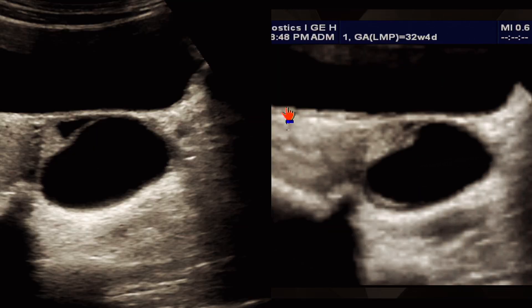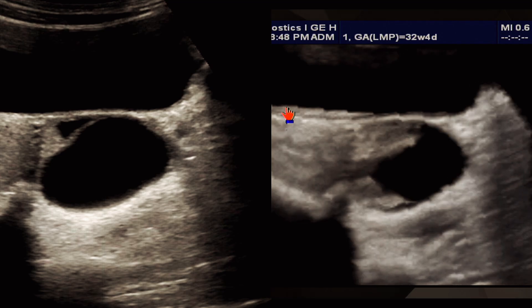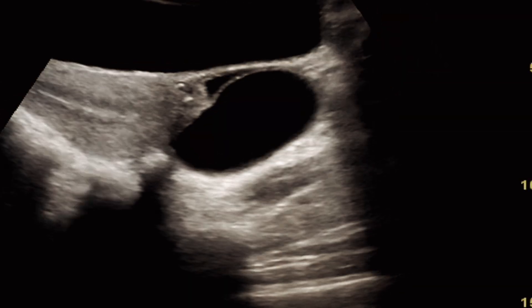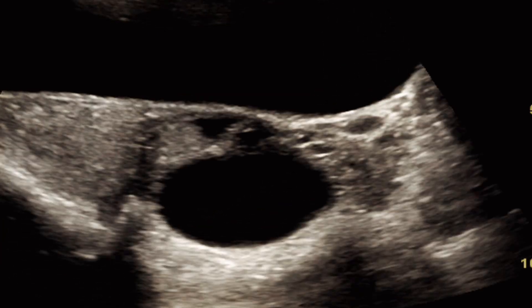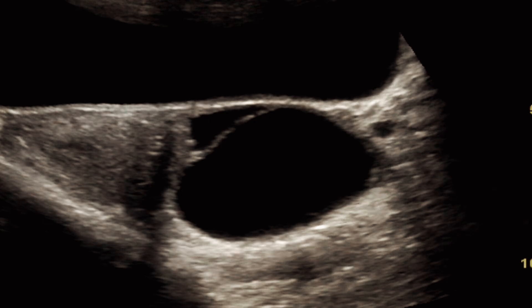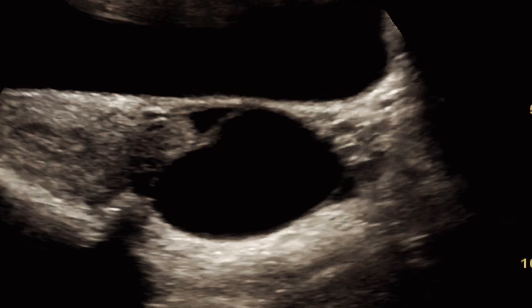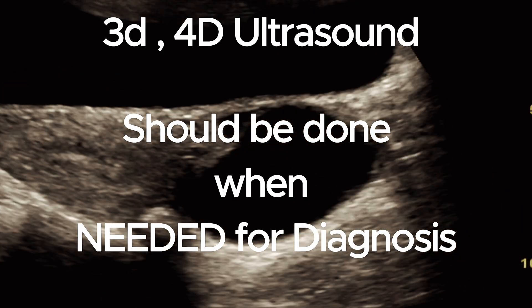While the 3D scan looks good, what is the use of this? The 3D or 4D scan increases the cost and time of the scan. The same information can be obtained from a standard 2D ultrasound scan in a significantly shorter time frame. Therefore, we only recommend 3D scans when they are truly necessary and provide additional value to the patient. There are also some advantages of 3D scans which we will cover in another case. These scans should be performed when necessary to better diagnose the patient, and not merely for the patient's preference.